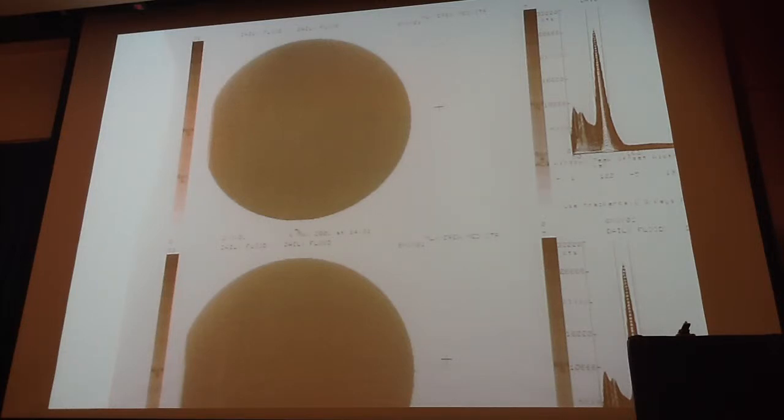But the cobalt source, on the other hand, is less messy. It's real easy to transport, put on there. But what would be a problem with using that? Once it gets old, it takes forever to do the flood. Yeah, the longer you have it, the longer it takes. But you can probably use it for a couple of years, 3 years, 4 years. Typically, they get about 5 to 10 millicuries in there, and then as it decays down.